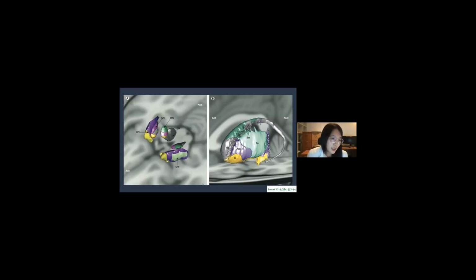For imaging, the main target is basal ganglia involved in dopaminergic signaling pathway. This is three-dimensional representations of the sensory motor, which is green color, association, pink and purple color, and limbic territory, which is yellow color, of the basal ganglia, superimposed in T1 MRI image.